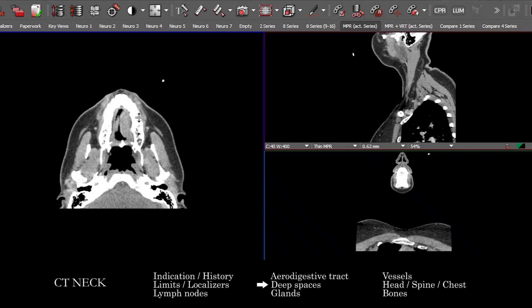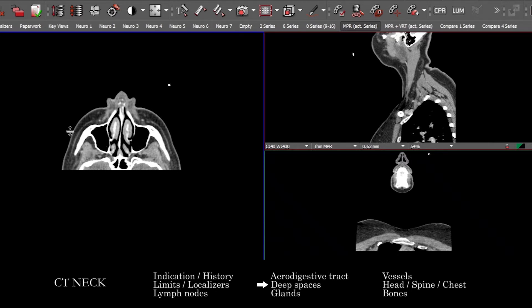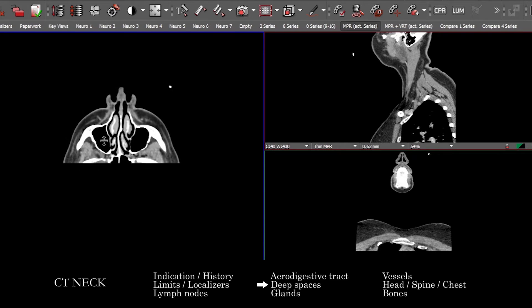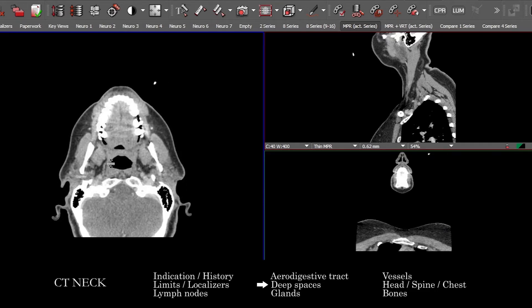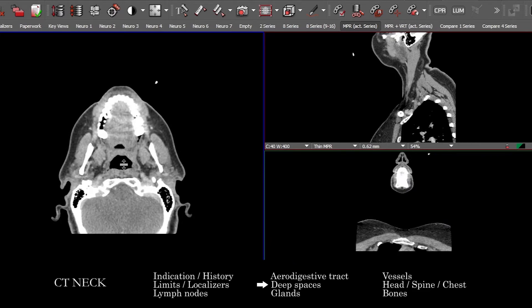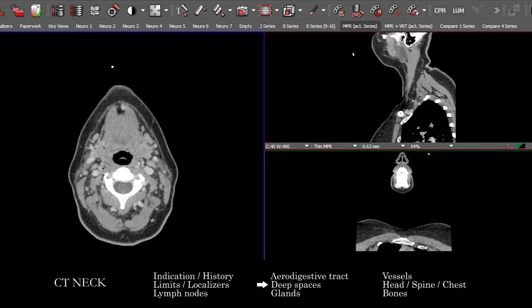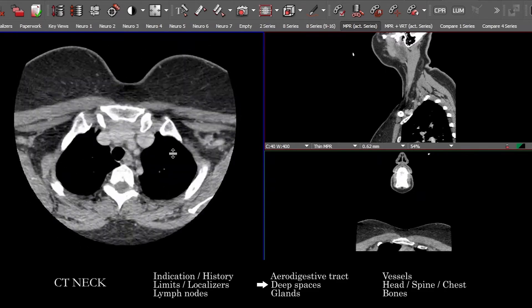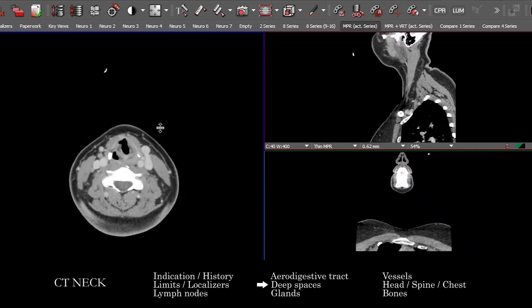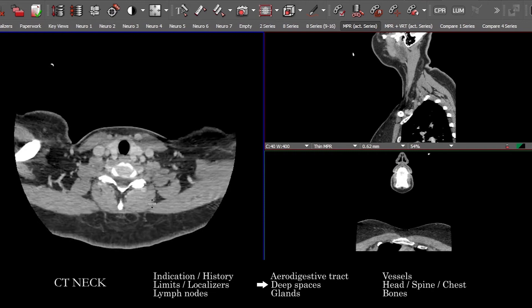That covers the aerodigestive tract. I also like to take a look at the various deep structures or deep spaces of the neck. There's so much complex anatomy. Starting at the top, you can even see the PPF — the pterygopalatine fossa. Once you come down, we get into the pharyngeal mucosal space. You have the parapharyngeal fat, the carotid space, the parotid space. You want to follow the carotid sheaths down through the carotid spaces, making sure there's no abnormal mass lesions, soft tissue stranding, infiltrative abnormality, or any other soft tissue lesion affecting those various deep spaces.